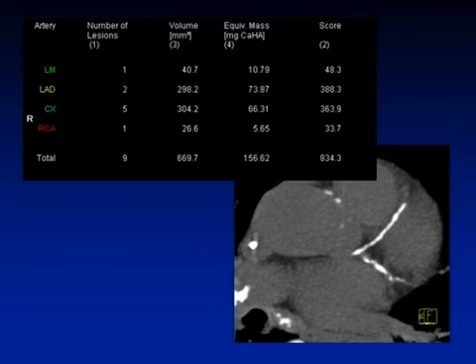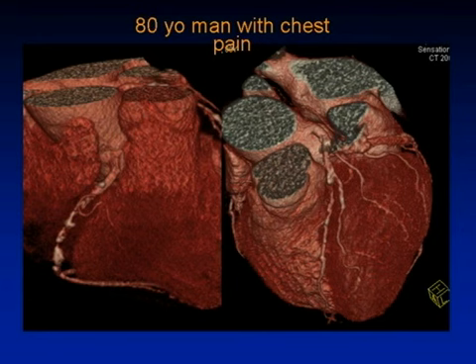In general, when you have long branching calcifications like this, those kinds of calcifications are going to be very difficult to see through, and they often block visualization of the lumen. So a patient like this with a very high calcium score with branching dense calcium like this, we probably would not do. But this is an example of why high calcium scores are a relative contraindication.